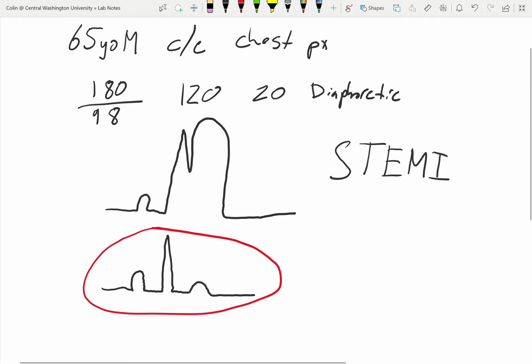The treatment's still the same. And so kind of like we've talked about in class, there's not one thing from your OPQRST or SAMPLE or your vital signs that absolutely sinks it, right? For example, we talked about pressing on the chest. Well, just because you press on the chest and it hurts doesn't mean they're not having a heart attack. So there's not one thing, and the 12 lead is like this as well. It's not the slam dunk thing that you think it is.